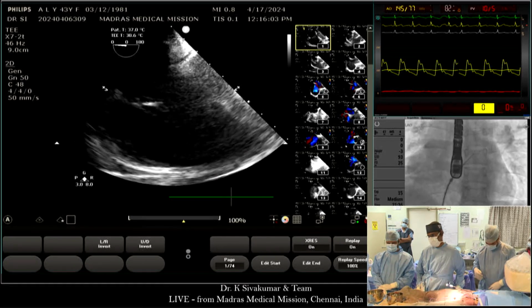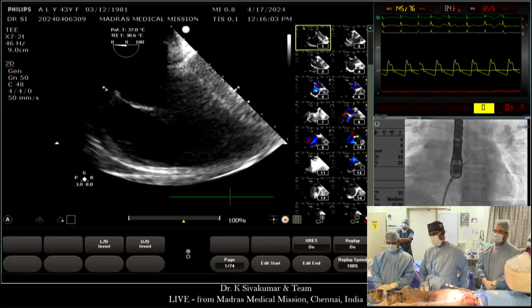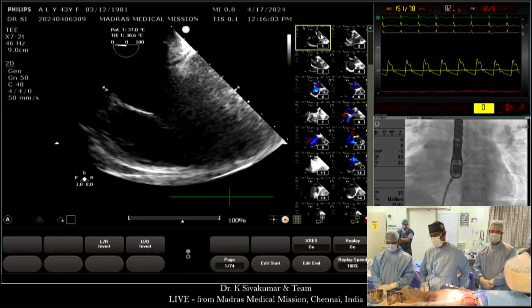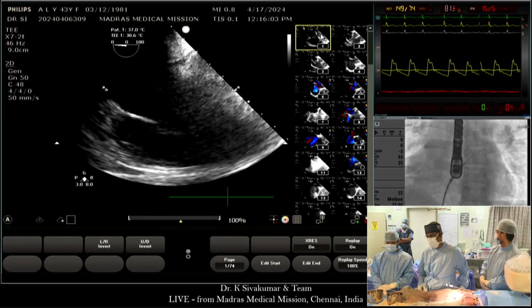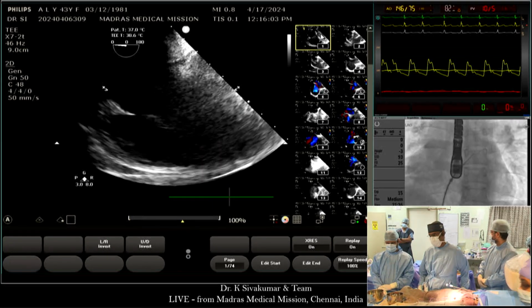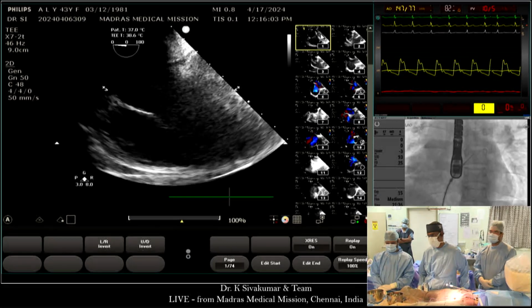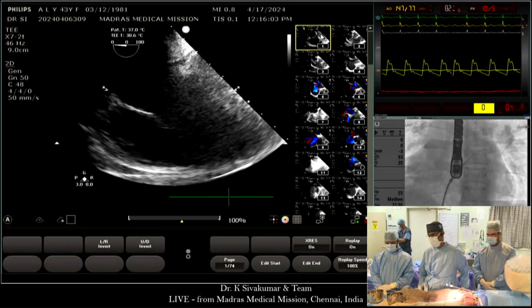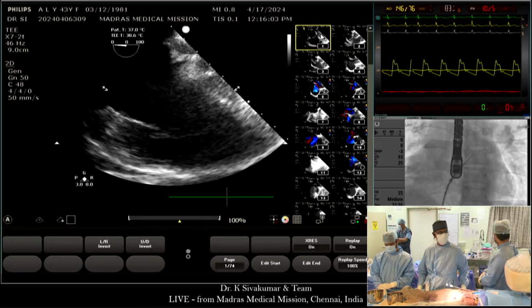If I see a pulmonary vein that is going to the right side, I usually, most of the time, do the same thing. The patching material for ASD is usually the fresh autologous pericardium, which generally does not calcify and will not generally cause future problems in terms of stenosis or obstruction. So the chances of obstructing the vein are minimal. Okay, thank you. Make it quick.